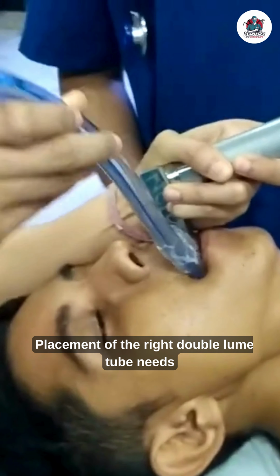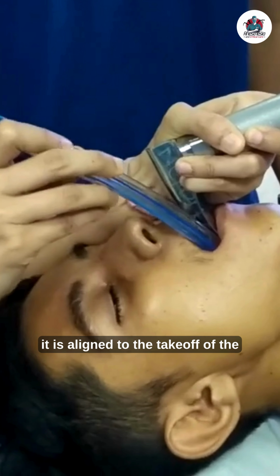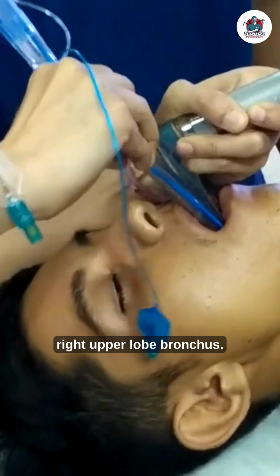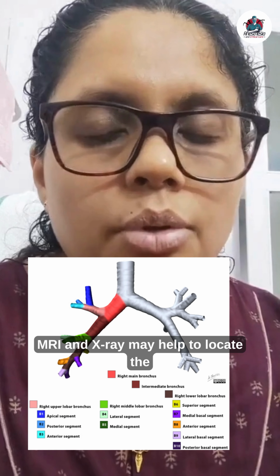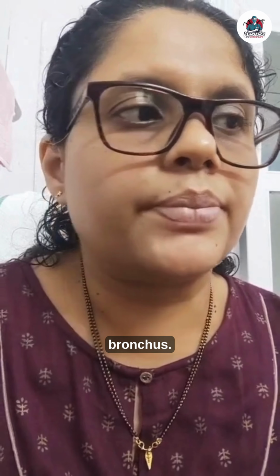The right double lumen tube needs to be positioned in such a way that it is aligned to the takeoff of the right upper lobe bronchus. A CT, MRI and X-ray may help to locate the position of the right upper lobe bronchus.